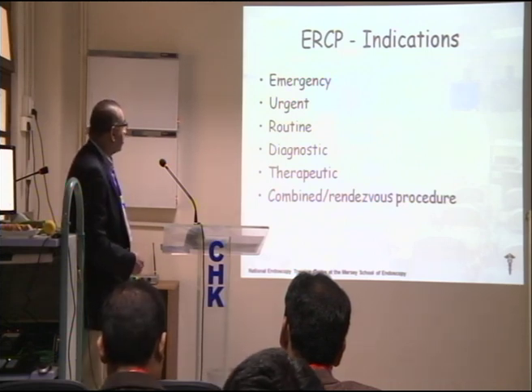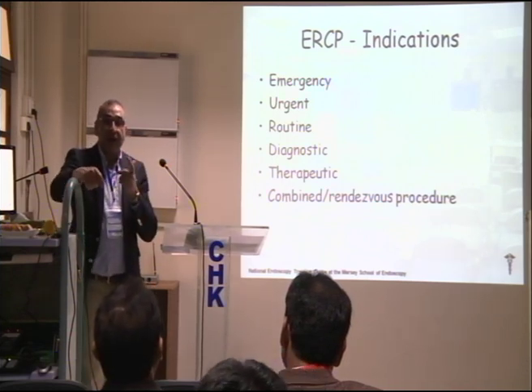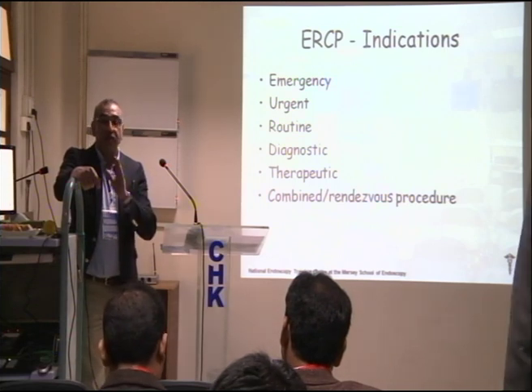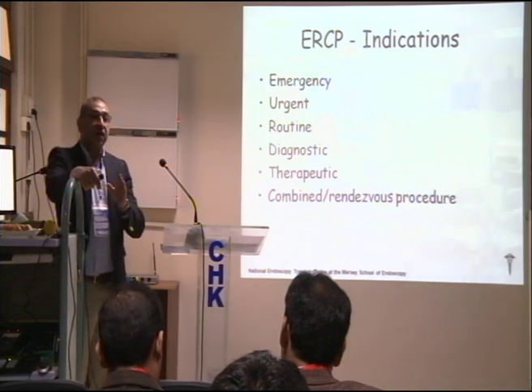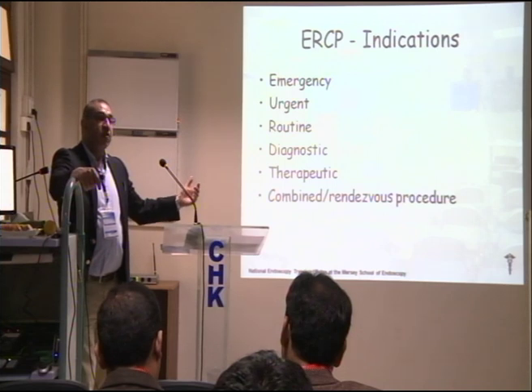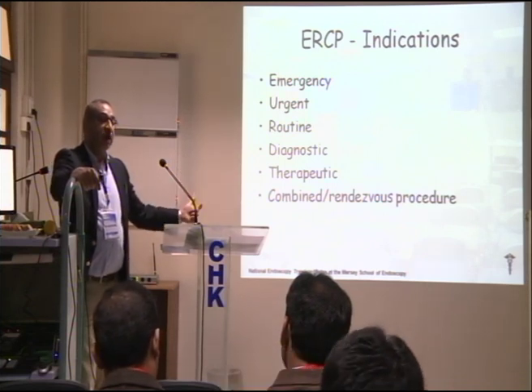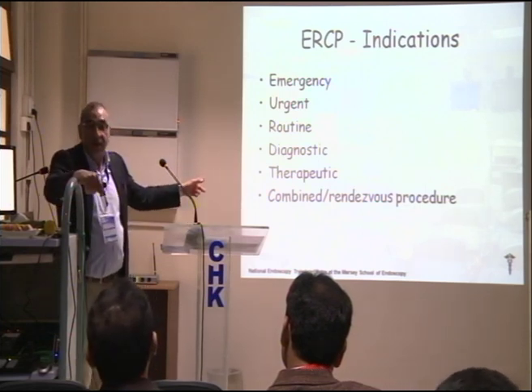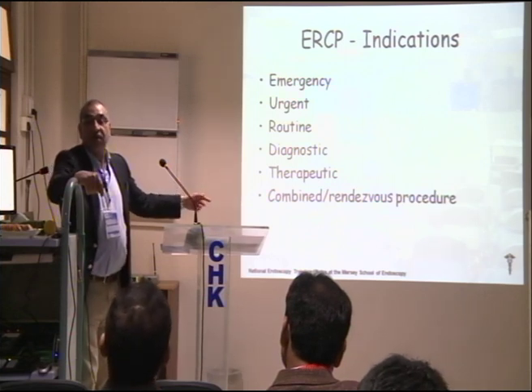Okay. So diagnostic, very rarely ERCP is done as a diagnostic procedure. We do not do ERCP with a diagnostic intent because there are other non-invasive procedures available. So why do you want to subject somebody to a risk of complications by doing an ERCP? So it is totally unjustified. That's why I've deliberately put it in. So I would not do an ERCP for a diagnostic reason.